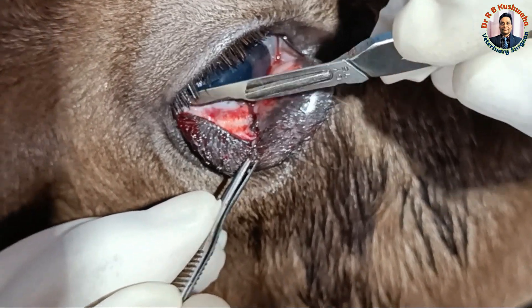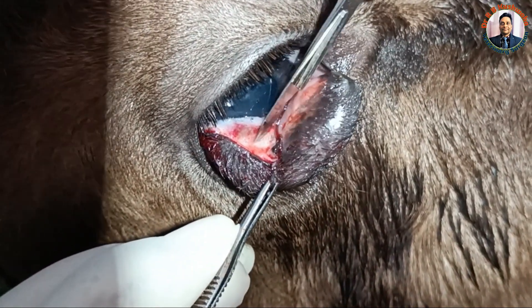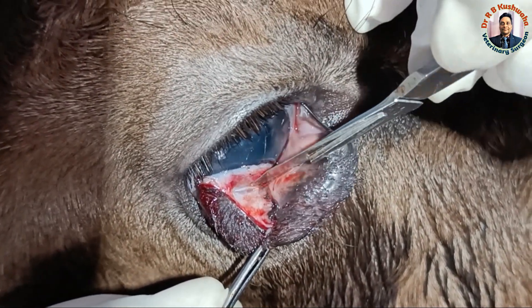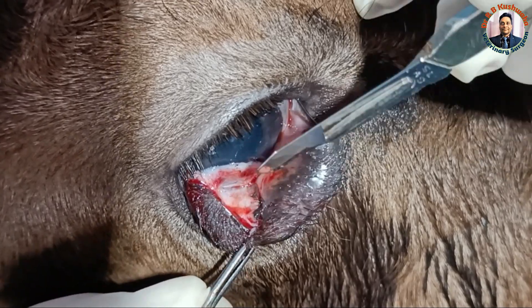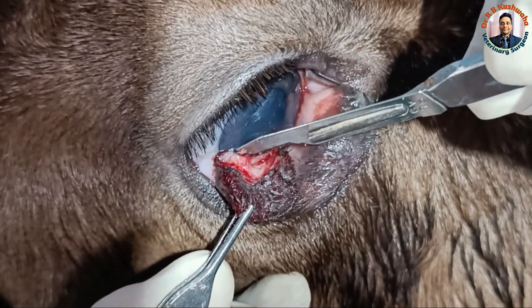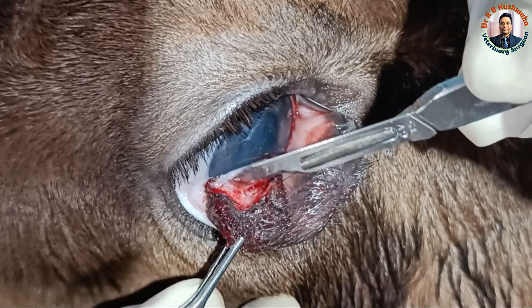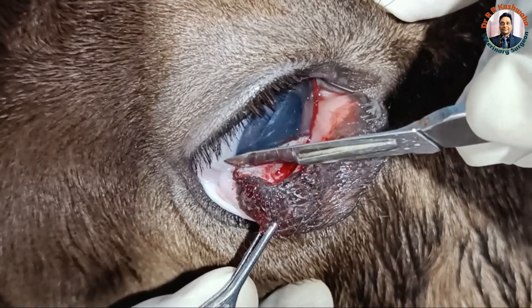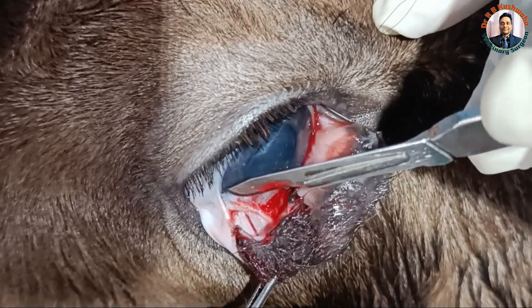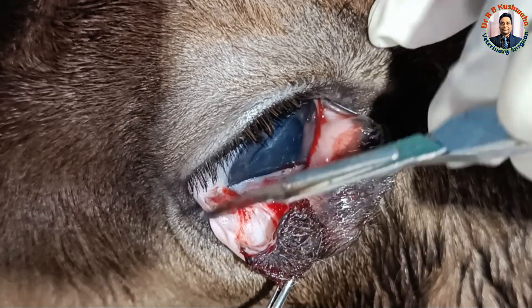Now you could see how carefully I am making the incision close to the cornea. From here onward, this is the bulbar conjunctiva. Now you could see — from here onward, this is the bulbar conjunctiva.